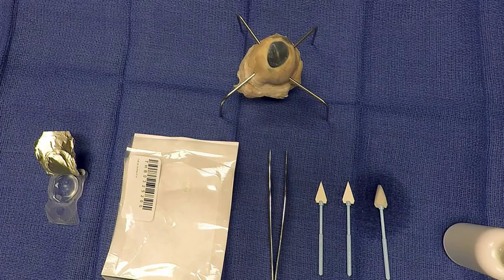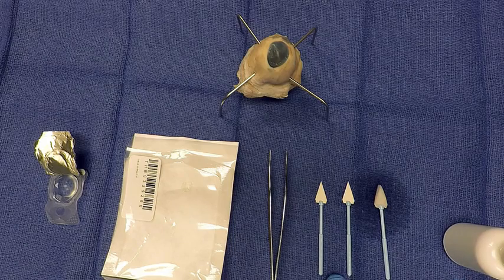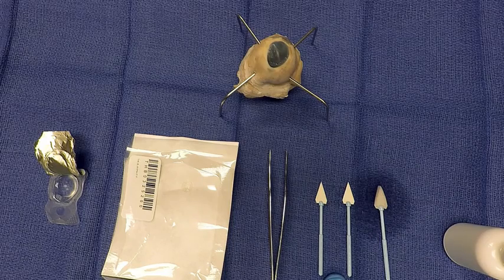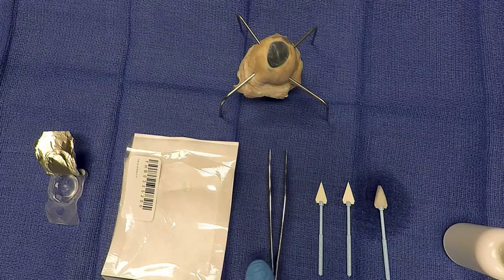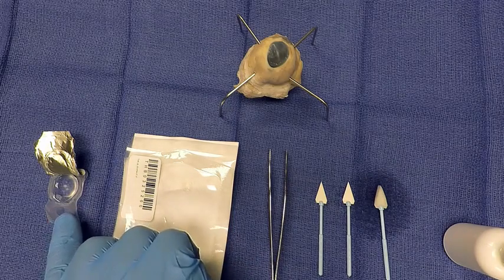The items suggested when performing this procedure in clinic are the anesthetic drops, a soft cell sponge to dry the ocular surface for better adherence of the membrane. This sponge can also be used to dry the bandage contact lens before application over the membrane. Smooth-tip forceps to allow for easy placement of the amniotic membrane. The Eclipse Amniotic Membrane, and finally, the bandage contact lens.